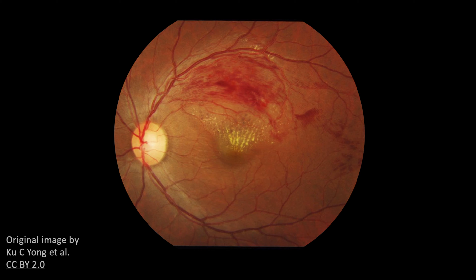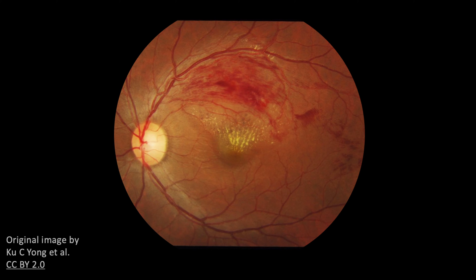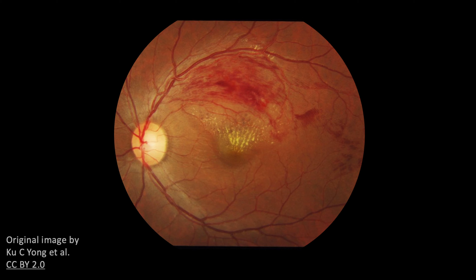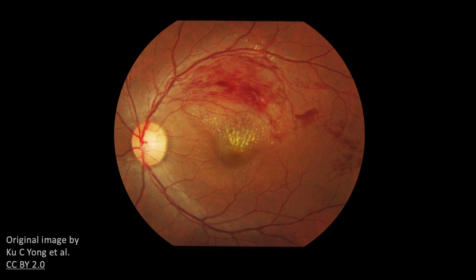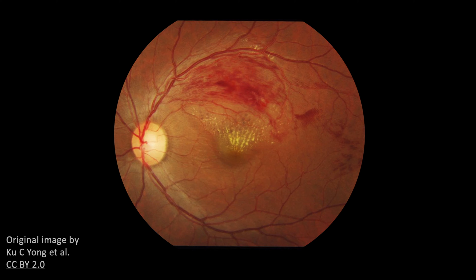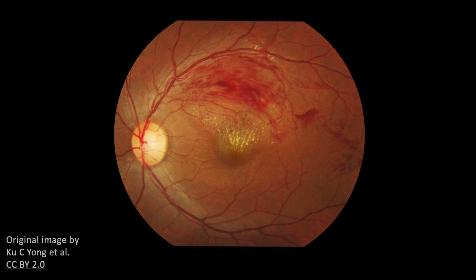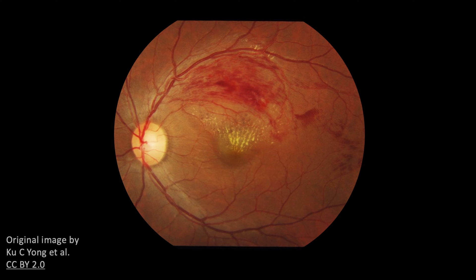In this fundoscopic image, there is evidence of a retinal venous occlusion. Flame-shaped hemorrhages are present along the course of a dilated and tortuous supertemporal vein. Note that hemorrhages begin approximately where the artery crosses over the vein.